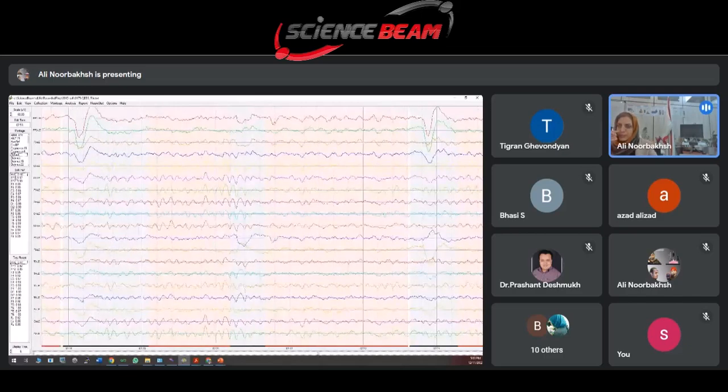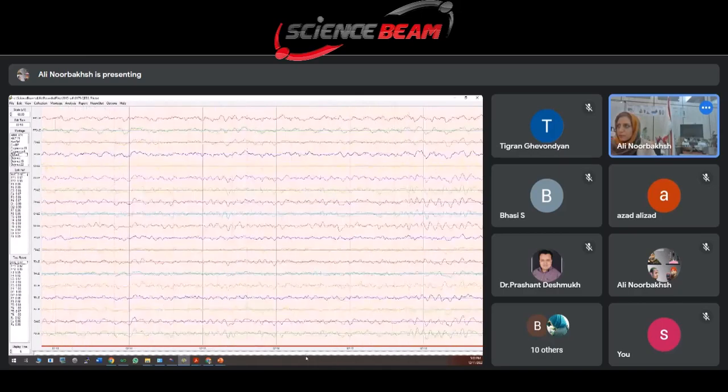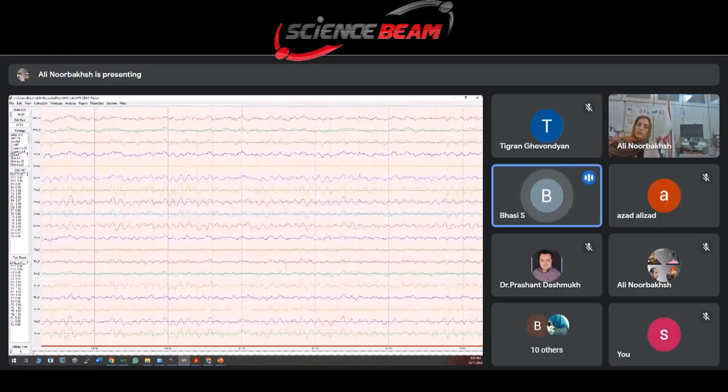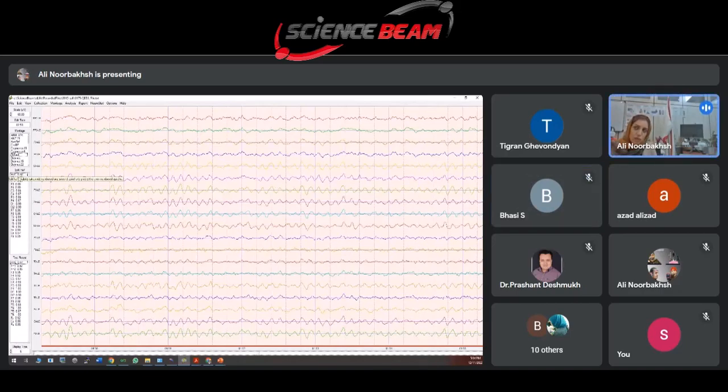There are two parameters, split-half and test-retest. It should be above 0.9. Could you repeat that? What are the parameters that decide a good signal? When does it become pink, and when does it go green and blue? It should be 0.9. Split-half and test-retest.